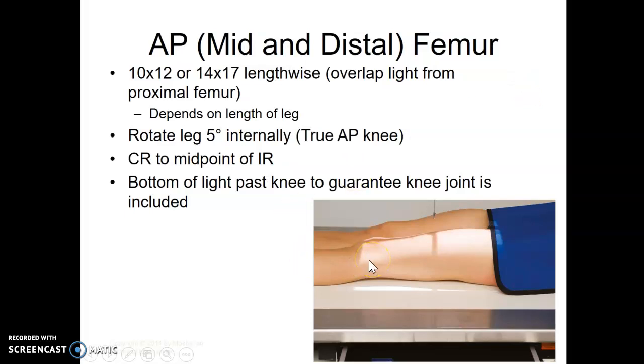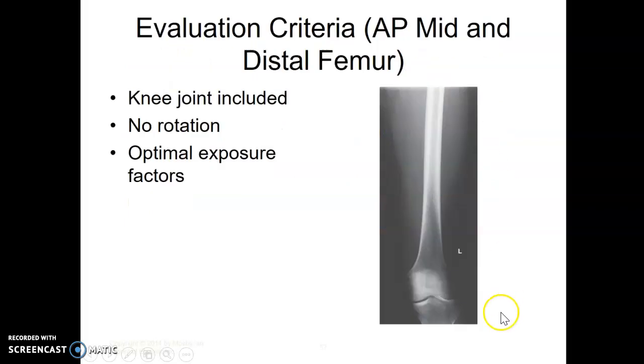Then depending on the size of their leg, you're going to either use a 10 by 12 or another 14-17. You need to overlap your light fields, so you're going to want the bottom of your light just below the knee to ensure that you have shown the entire femur. You want the knee in true AP position, so rotate that leg however much you need to. We call this one knee up — this is your distal femur, knee up, making sure you overlap your light fields.